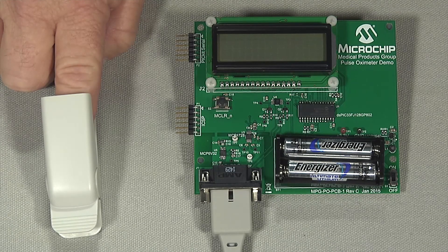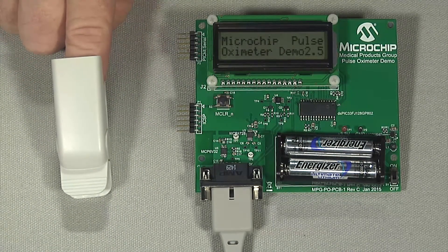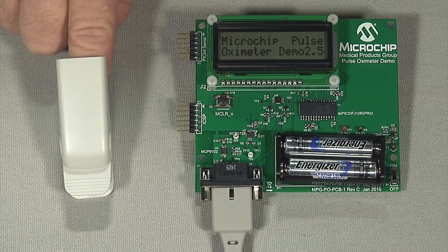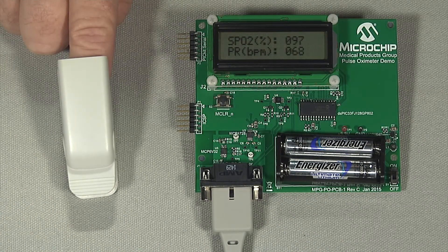Let's see what the whole measurement process looks like. My finger is in the probe, so now I'll start the measurement by pressing the button on the demo board and look for the results on the demo board's LCD display. By the way, the LCD display is driven from an integrated PWM on the same DSPIC33 DSC. There, the DSPIC33 has measured and calculated my heart rate and blood oxygen level. It reads 97% blood oxygen level and a heart rate of 70 beats per minute. That's correct — it's good to know that I'm healthy.